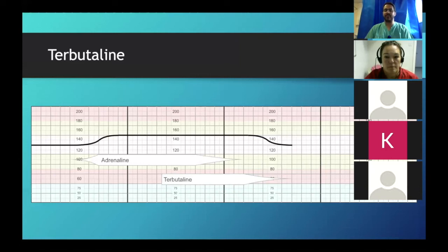So it's either that the baby is still stressed, so the adrenaline has not gone away, or there's an infection as well. Or there was no adrenaline to start with, and this was actually an infection. So the rise in baseline was not necessarily because of the adrenaline, it was actually because there was an infection going on, and you have just now made the baby more tachycardic rather than being better. Does that make sense?